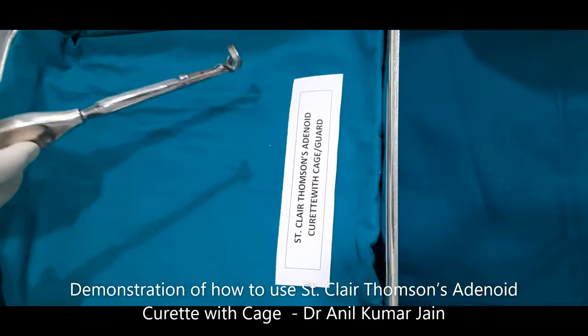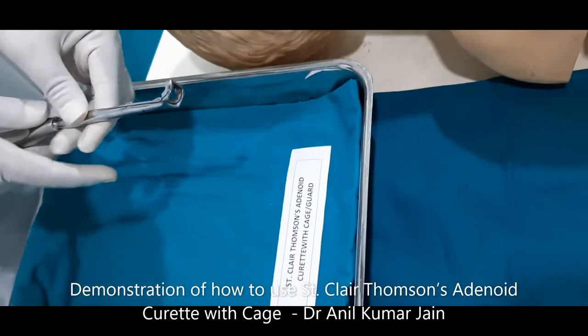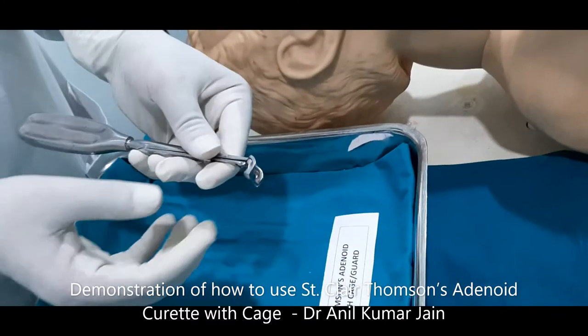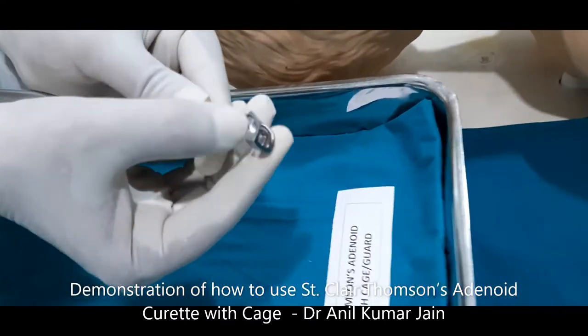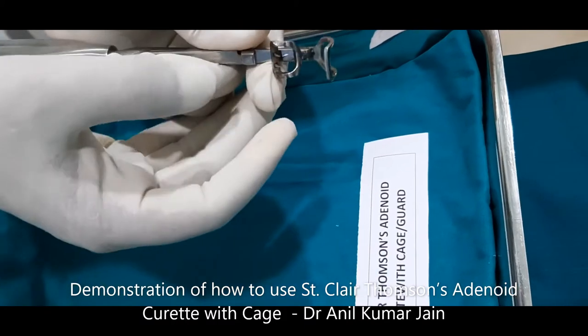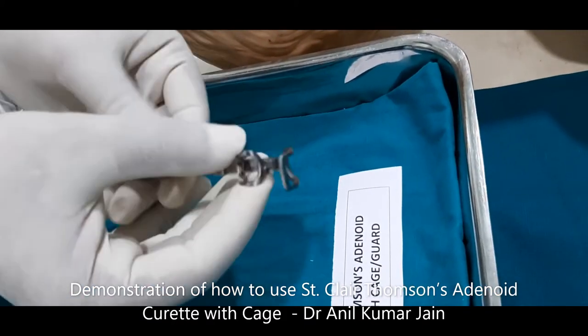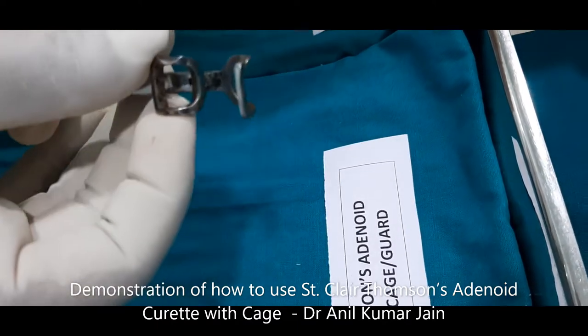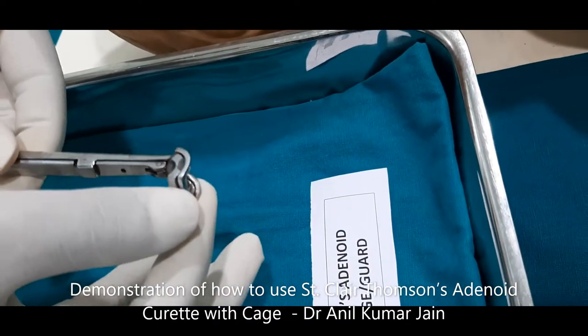This is called a cage or guard because you can see it is having a guard over here which you can open. You can see there are teeth, and when we have to use it we have to close it.